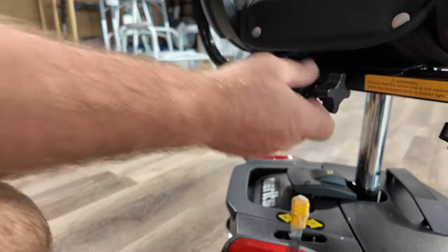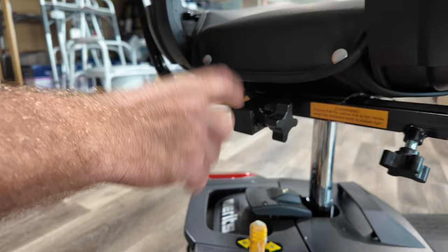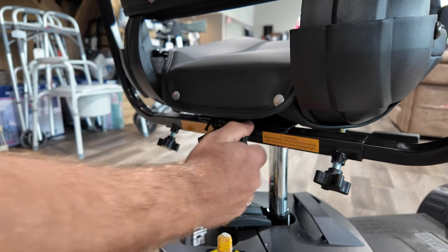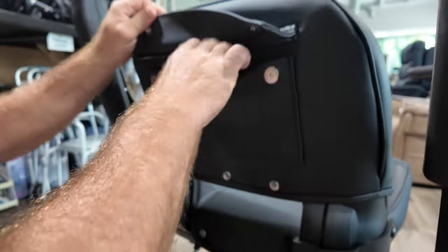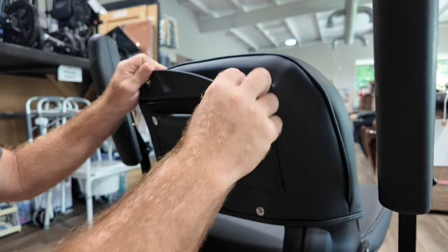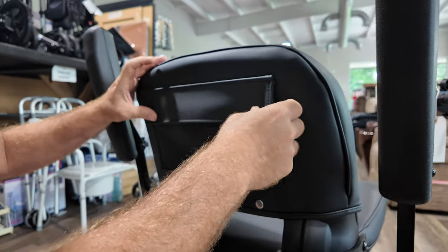On this seat, you also have the back port for an oxygen tank holder, basket, or whatever you may put in there. You just remove this cap, twist this out, stick it right in there. There's also a small pocket back here — maybe you can hide some cash or a fold-up umbrella. It's not very big, but it's there.